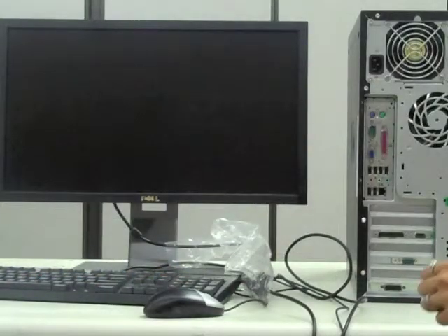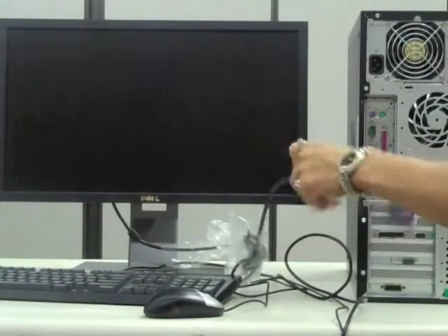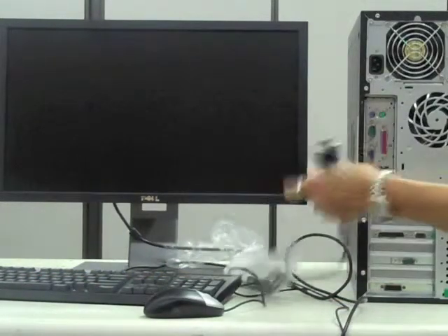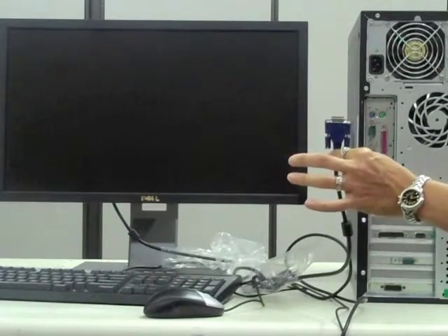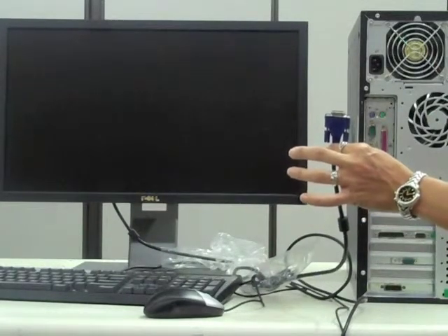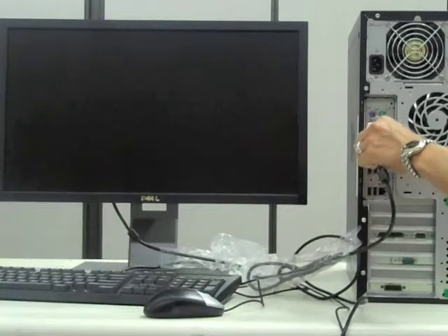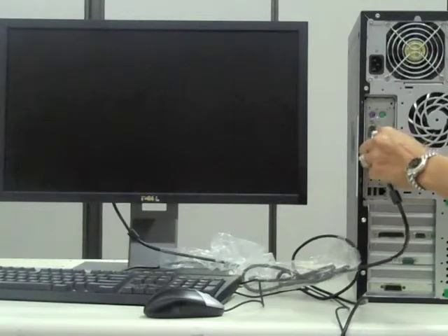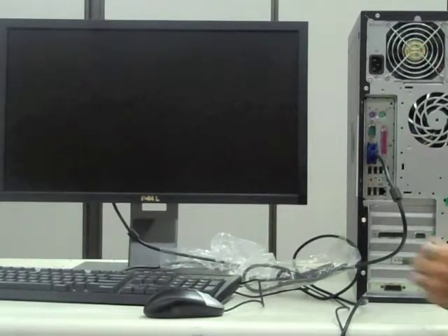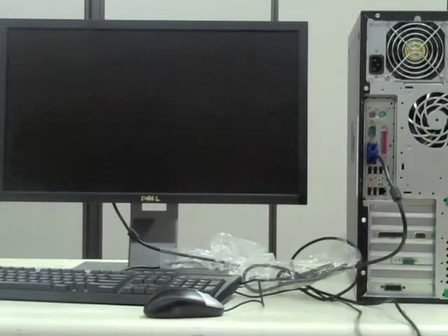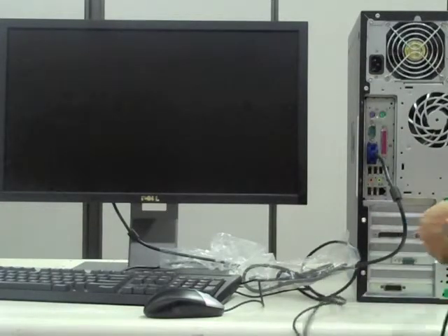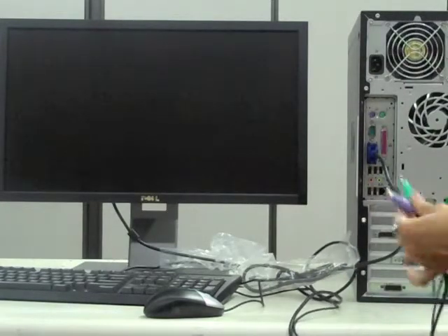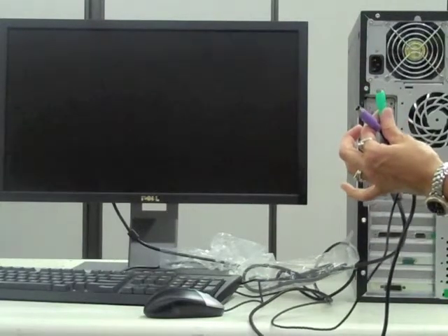Start by hooking up the central station. First, connect the monitor using the standard VGA cable to the video output connector on the back of the central. Next, connect the keyboard and mouse to the respective ports, either PS2 or USB depending on the desired configuration.